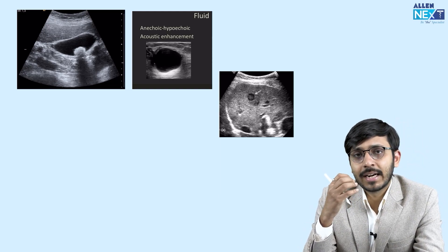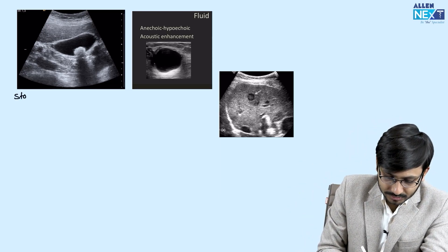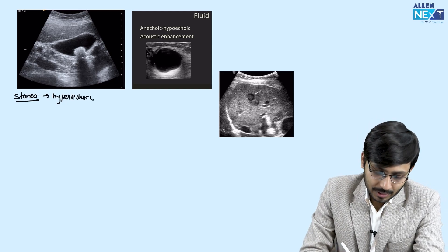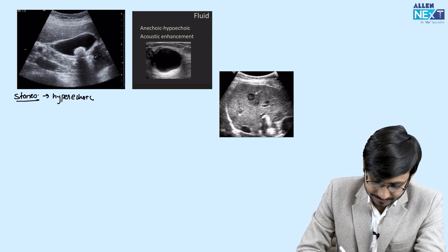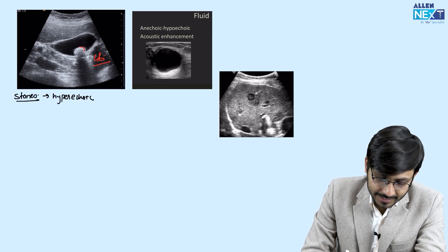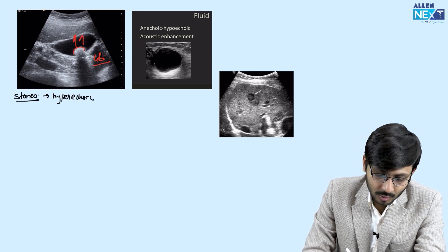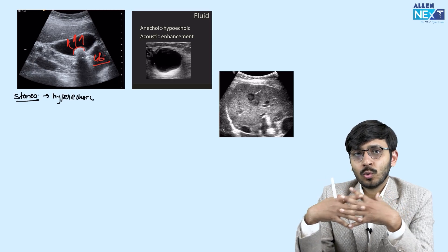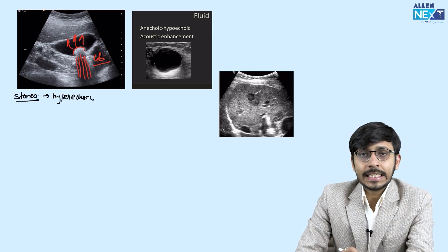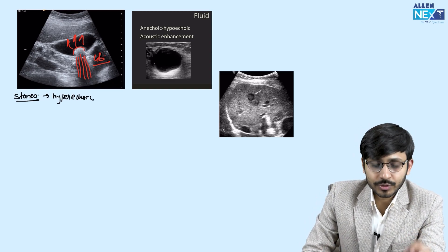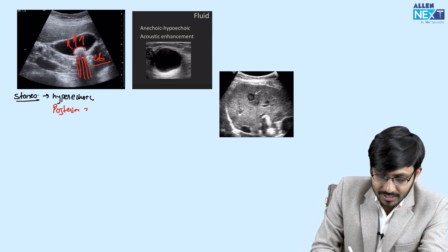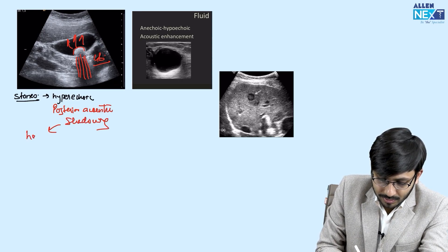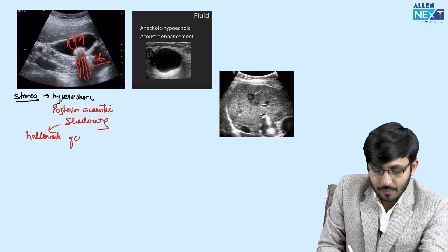If sound waves are reflected completely, for example like stones, they appear very hyperechoic. This is a GB calculus — we see it appearing very bright on ultrasound, reflecting all the sound waves. Hence it is hyperechoic. Since no sound waves are transmitted through the stone, there appears a posterior acoustic shadowing. This is the hallmark of calculi.